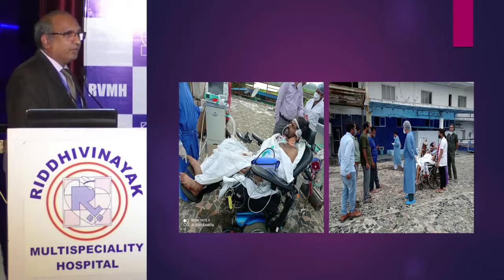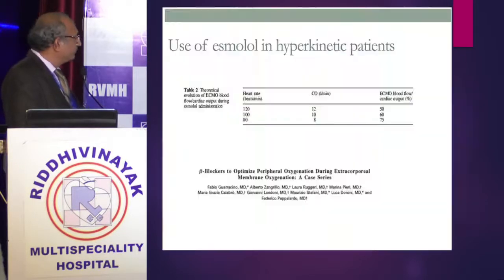Usually what happens when we put the patient on ECMO, we just look at the saturation, we keep the patient absolutely immobile so that nothing goes wrong. And in that we are not helping the patient, but we are rather harming the patient because we are not putting any active efforts for the lungs to improve.